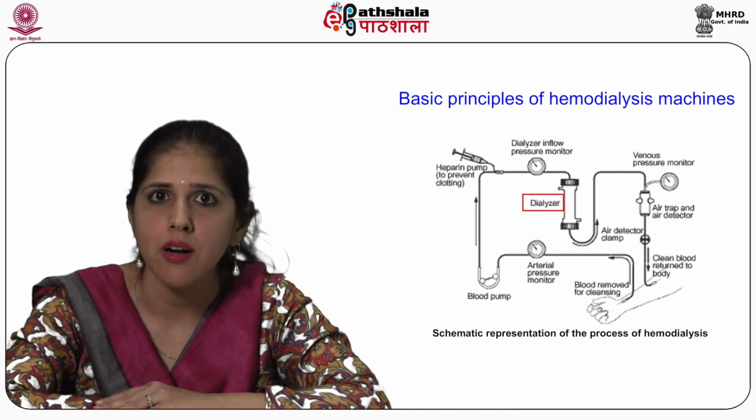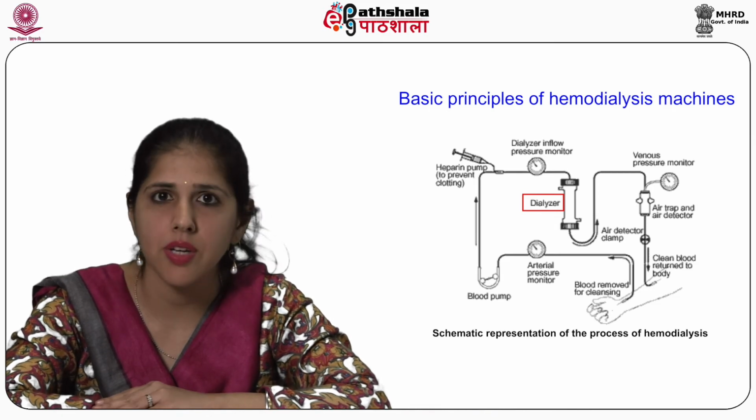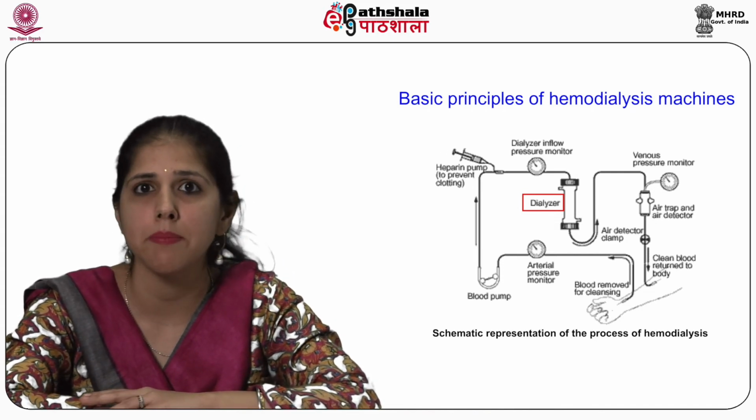Then we monitor the pressure of the blood which is going inside the dialyzer. The dialyzer is the part where the exchange process will occur and the blood will be cleansed.